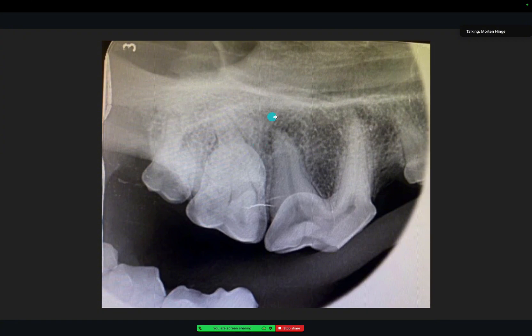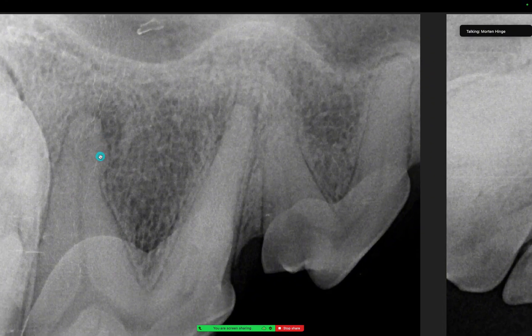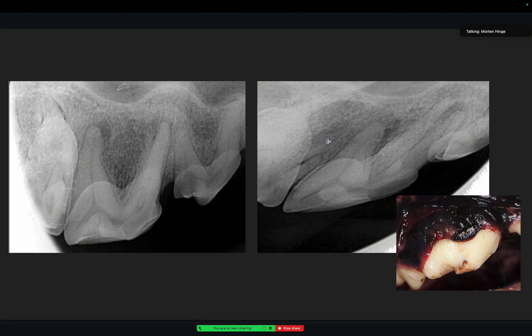This is another case of a lucency around this root tip here — you can see it's more like a shadow. And again, this is a complicated fracture of that tooth. You see a slight shadow here as well. Take some more projections, please, just to be sure. You see a shadow here, and there's also one up here. Once you see many pictures of this, it will get easier and easier.